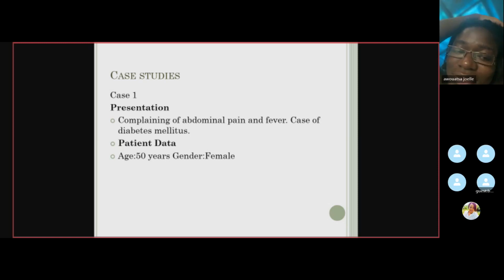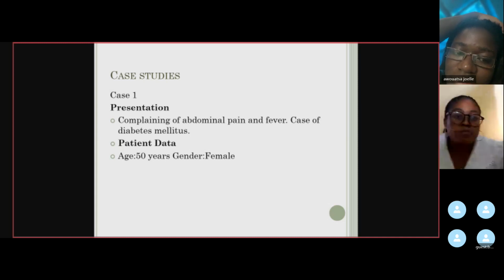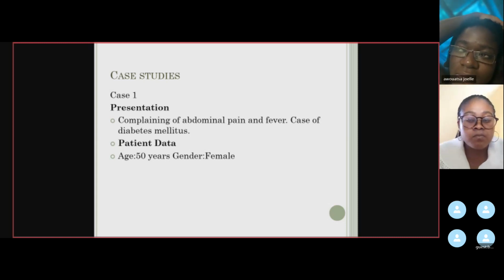I'm just telling that you have to learn the protocols. That is how to do the abdominal scan. What is the patient preparation to be done? What all scans you'll be taking? Which all views? That is transverse view. You will scan the liver, the pancreas, the kidneys. Then in cardiac, all the 4 views you have to take. If there is a question about cardiac, then you have to mention all those 4 views.